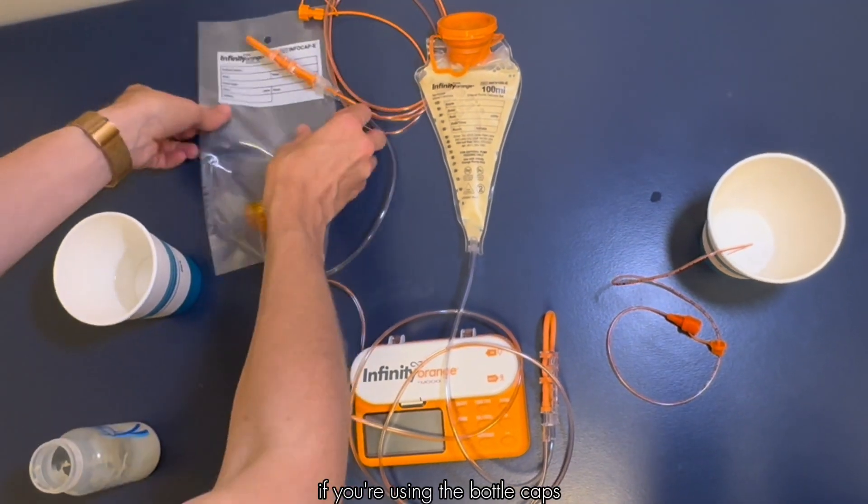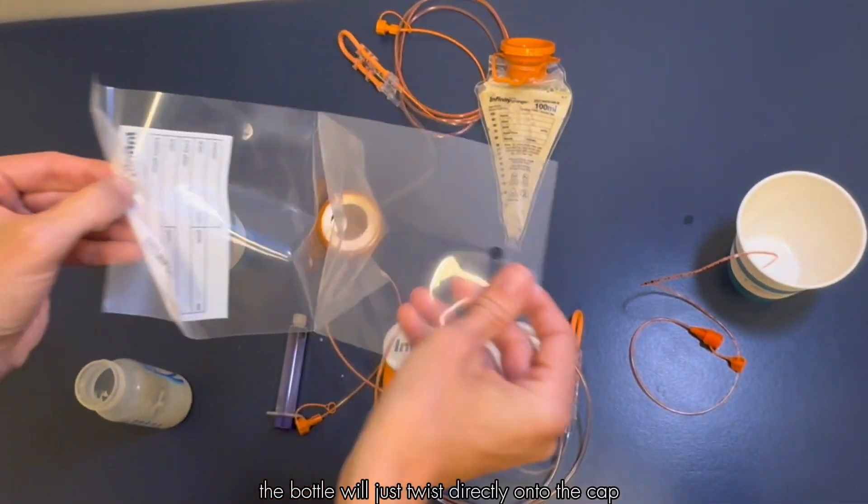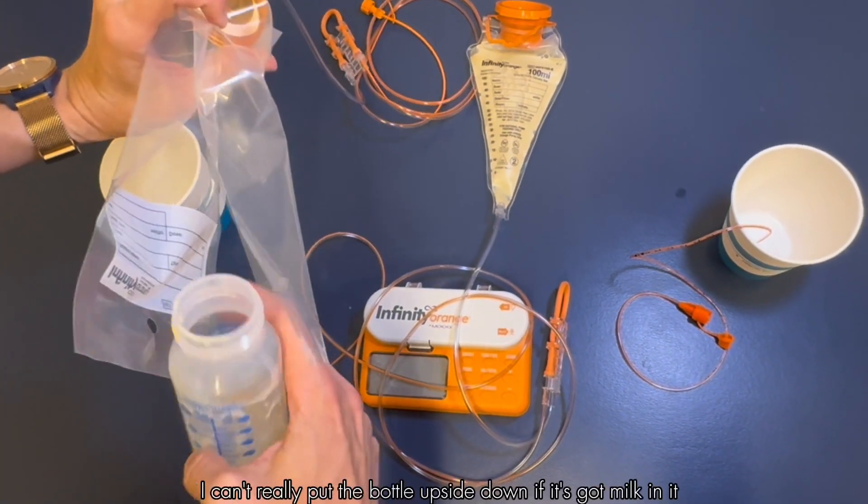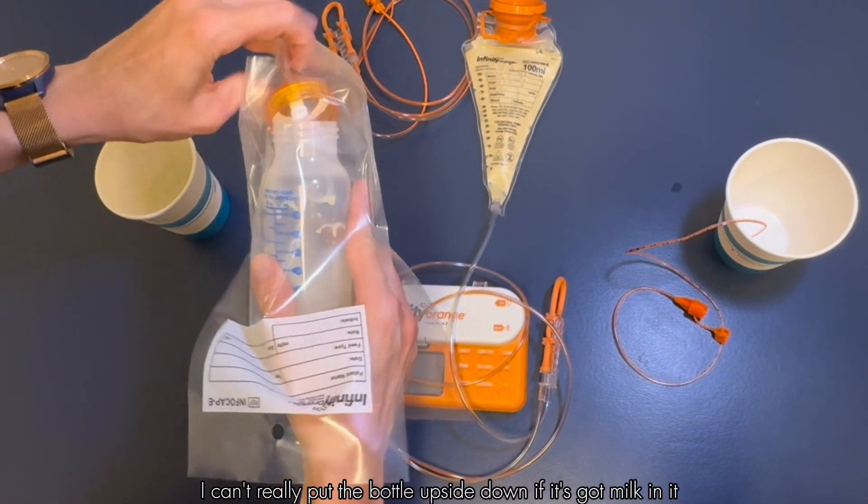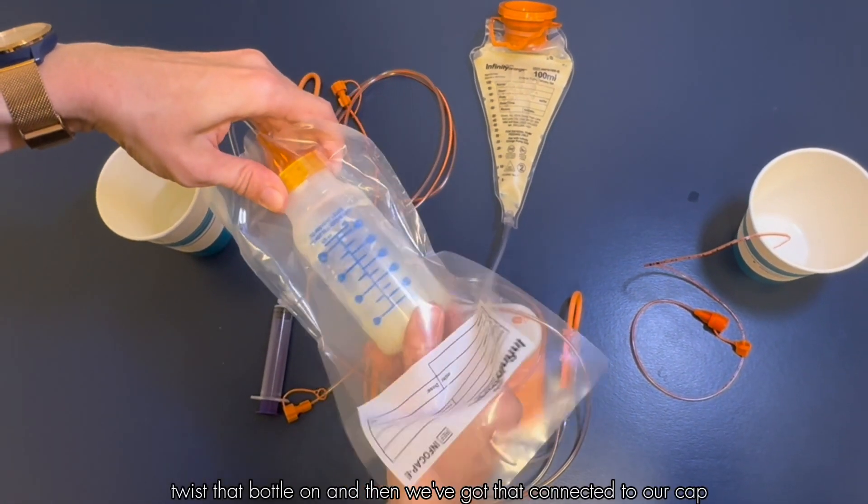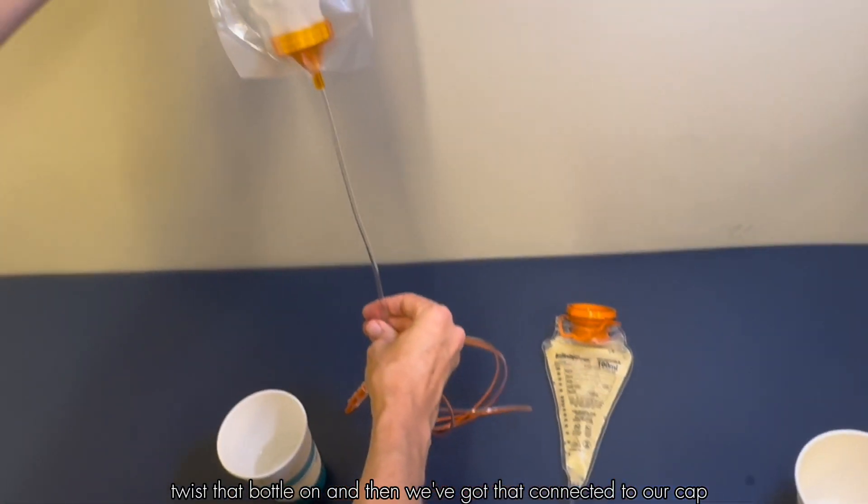If you're using the bottle caps, the bottle will just twist directly onto the cap. In that situation I can't really put the bottle upside down if it's got milk in it, so I'm going to put the cap upside down, twist that bottle on, and then we've got that connected to our cap.